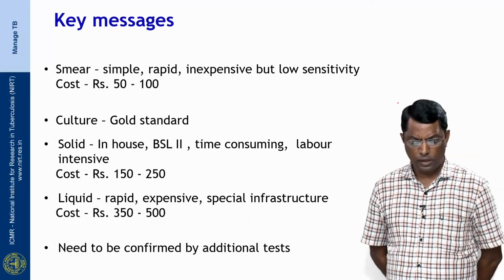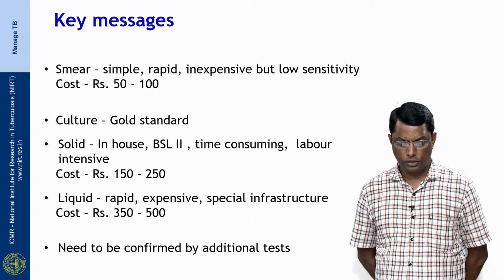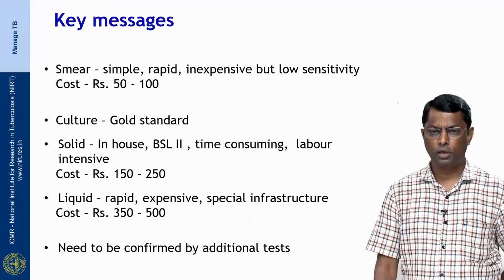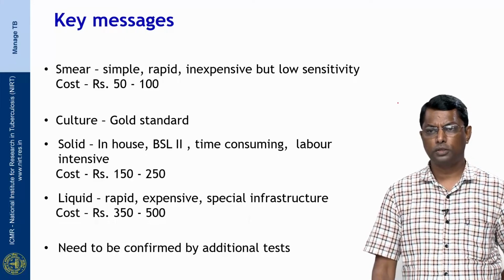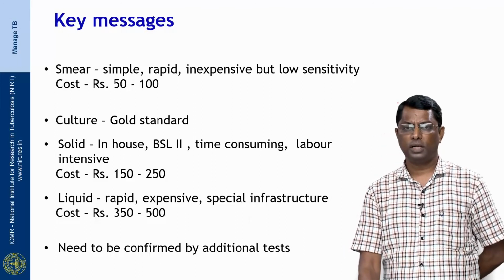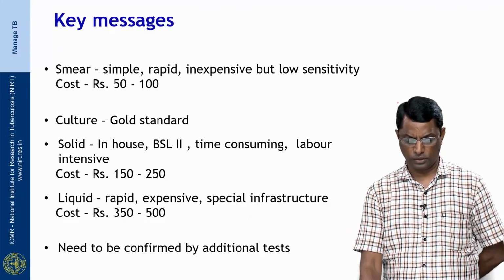So, both solid and liquid culture require additional tests to confirm whether it is Mycobacterium tuberculosis or non-tuberculosis mycobacterium, or for drug resistant and drug sensitive strains.